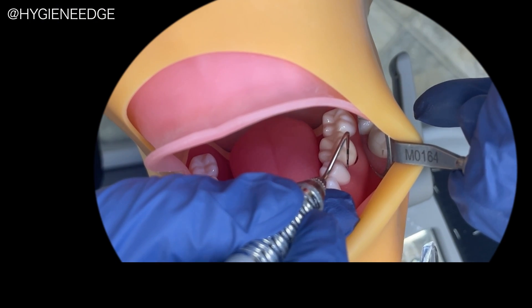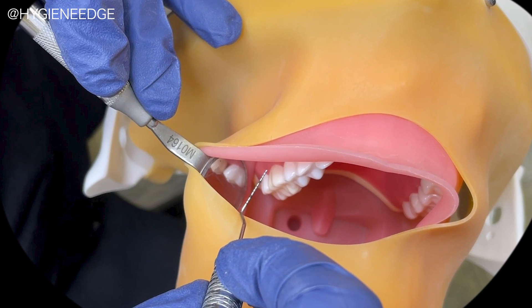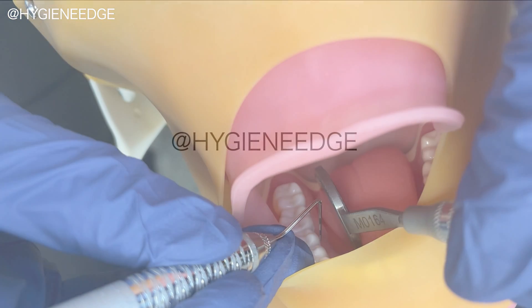Kilgore has product options with the tongue, cheeks, and face covers, and I recommend practicing with all of them in place as they will help you to practice all of the concepts of probing such as mirror use, retraction, advanced fulcruming, and clinician and patient positioning.